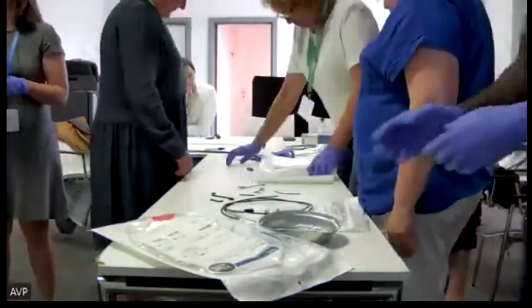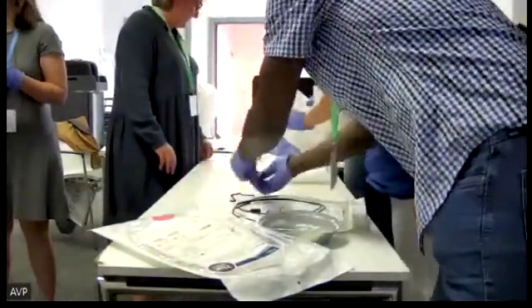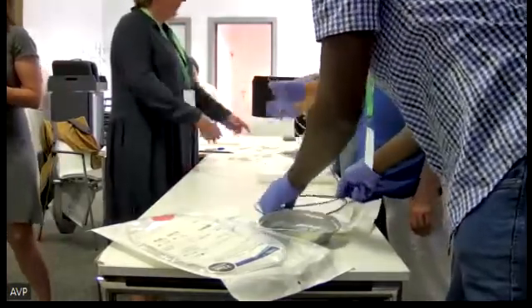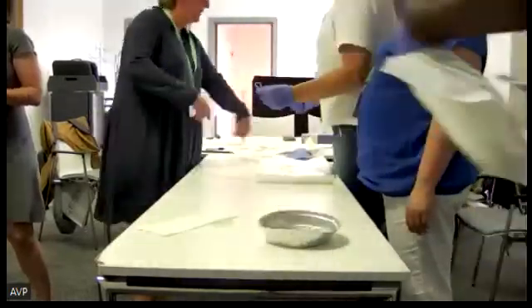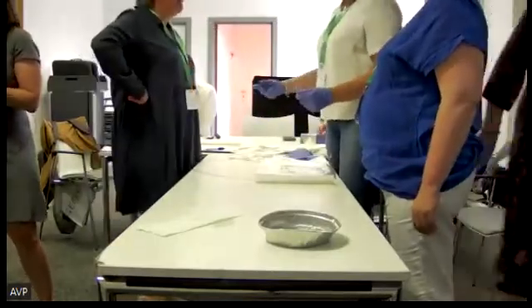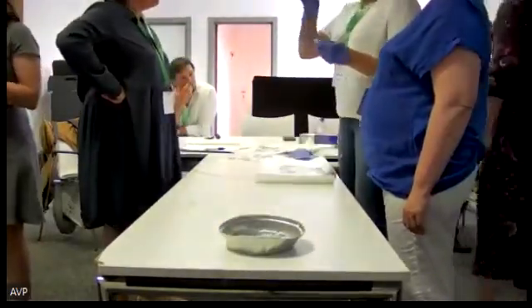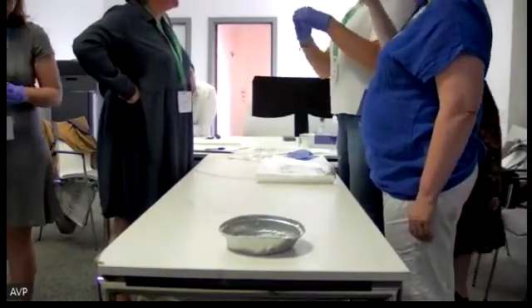I think the needle form is different. Yes, the Procore is the FNB, but we don't use the Procore anymore. We use the new generation FNBs, which are the Boston Acquire, the Shark, Medtronic, and Microtech also has a new generation. The Procore is a bit old school. It's an older needle. Good to know.